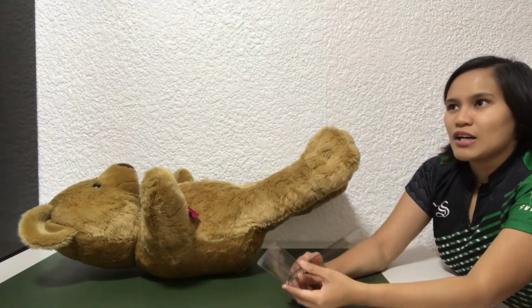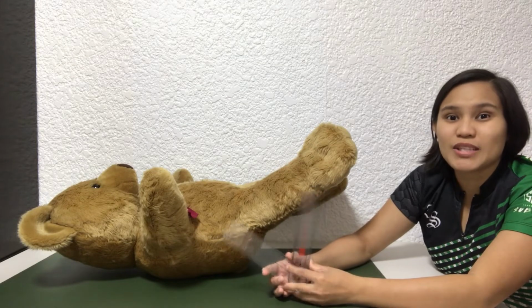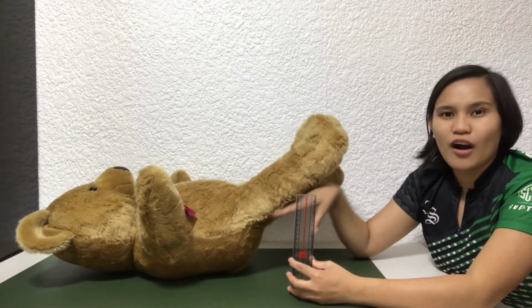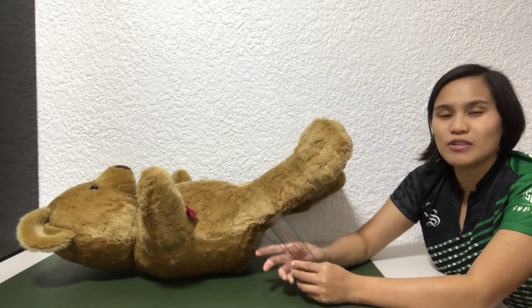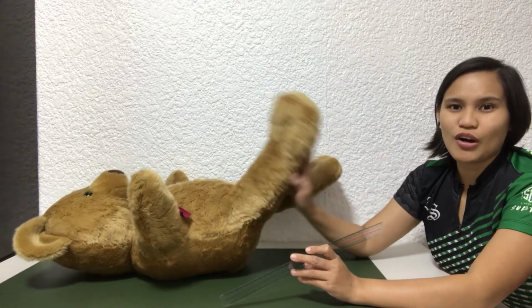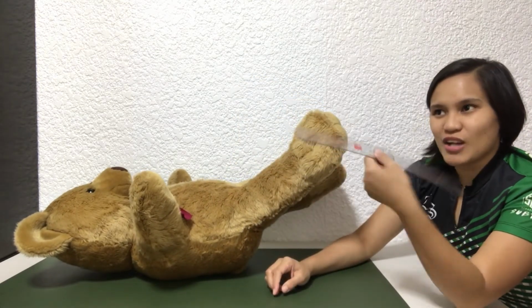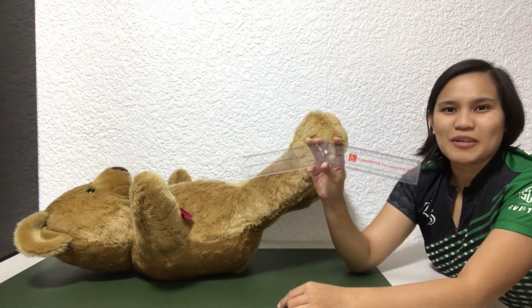Usually for a human, the normal hip flexion is 0 to 90 degrees, considering that there is no tightness on the other muscles. Now, for example, if Mr. Teddy only reached up to 60 degrees, then somehow we could say that there is a limitation of motion on his hip flexion. So, that is a quick demonstration on how to use the goniometer. Okay?